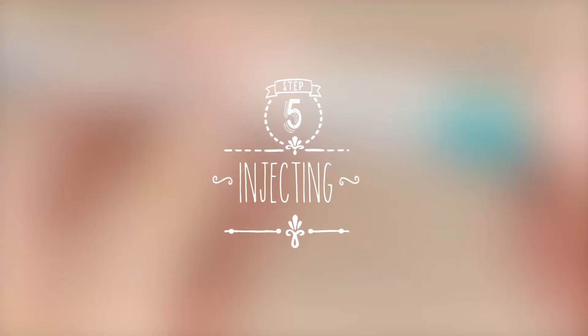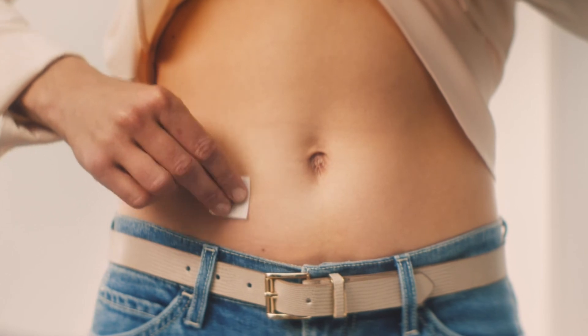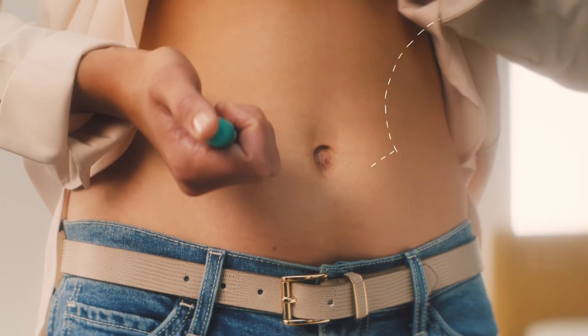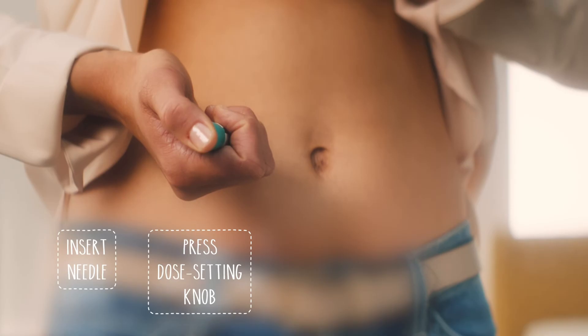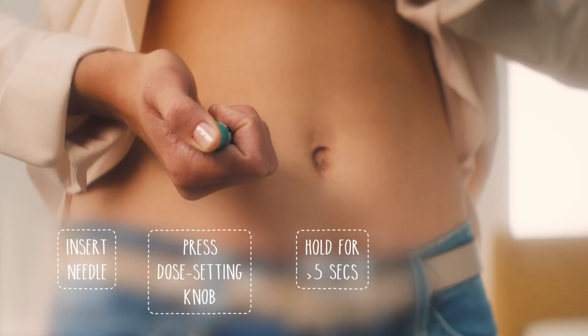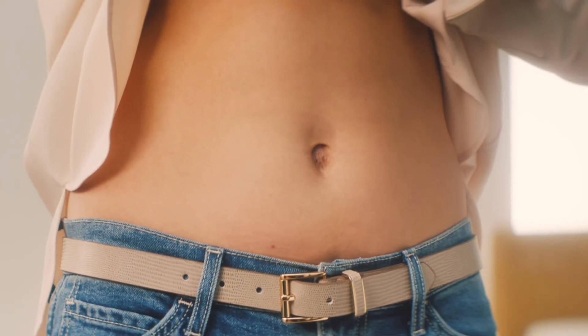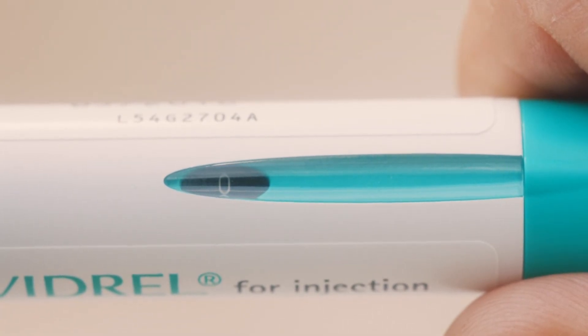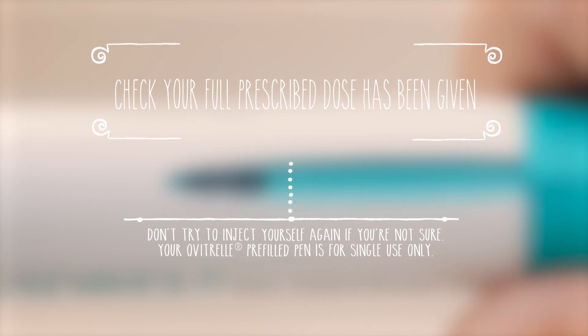You're ready to inject. Your doctor or nurse will have explained how and where on your body you should inject. Clean your skin with an alcohol swab in the place where you're going to inject and let the area air dry. Hold the pen with one hand and check once more that the number in the dose display reads 250. Remove the green inner needle shield carefully if you did not do it whilst removing air. Now slowly insert the entire needle into the skin. Push the dose setting knob right to the end with the needle still in your skin, then keep pressing the dose setting knob and hold the needle in your skin. Pull the needle out of the skin while keeping the dose setting knob pressed down, then release the dose setting knob. Once you've finished, check that the number in the dose window reads zero — this means you've given yourself a full dose. If it doesn't read zero, don't try to inject yourself again, but speak to your doctor or nurse.